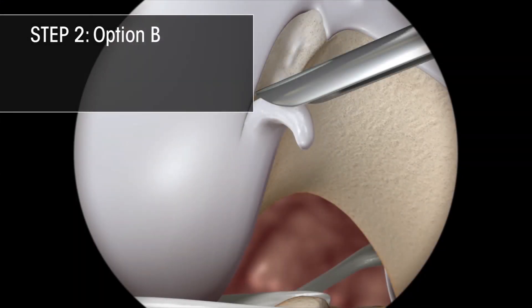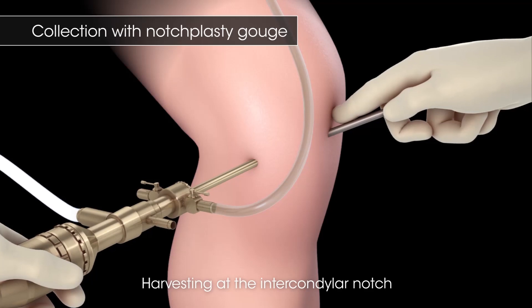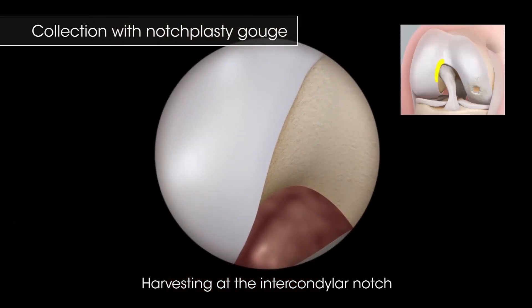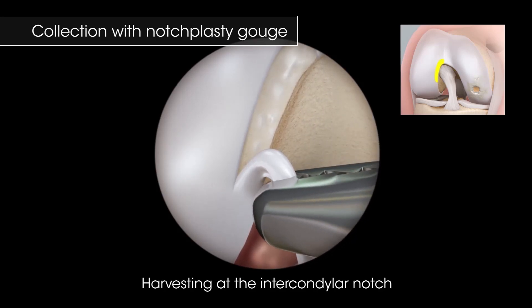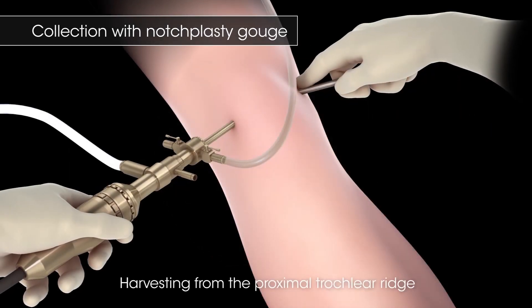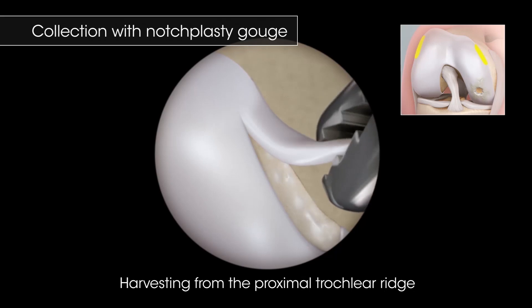Collection of the Patient's Cartilage with a Notchplasty Gouge. For harvesting at the intercondylar notch, flex the knee approximately 90 degrees. Starting at the anterior aspect of the notch and working laterally, use the gouge or ring curette to elevate tissue from the lateral condyle. Leave the distal end attached and remove the tissue with an arthroscopic grasper. When harvesting from the proximal trochlear ridge, fully extend the knee and, using similar technique, work the gouge proximally to elevate tissue.